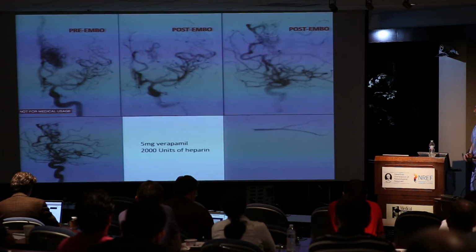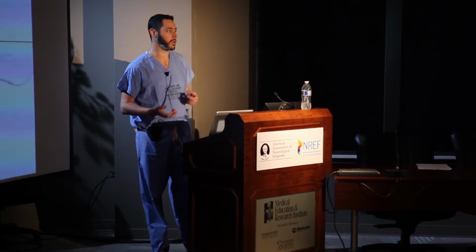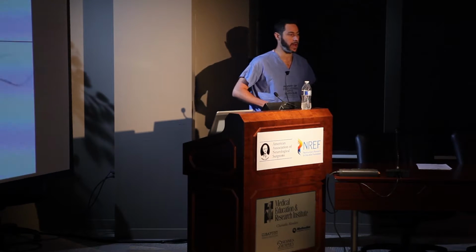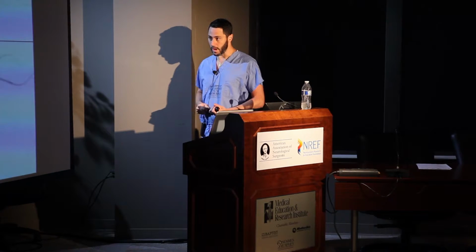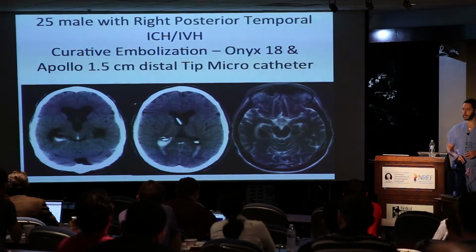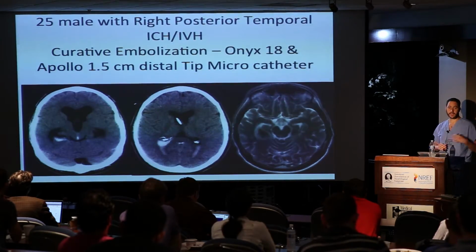Okay. So to me, this is a segue into talking about technique, and knowing the pitfalls of the technique, and probably what I did too long, because I left the microcatheter on tension too long and stretched the artery. Okay? Cause it to spasm and maybe form a clot, but we're able to get it open. So thankfully, we have new techniques. We'll have other pitfalls, but the development of Apollo, I think, is a nice step forward.